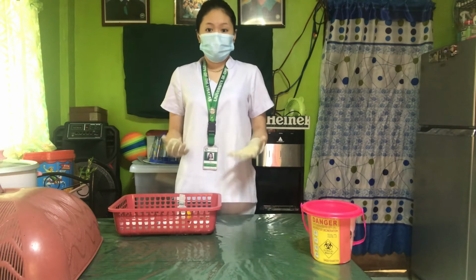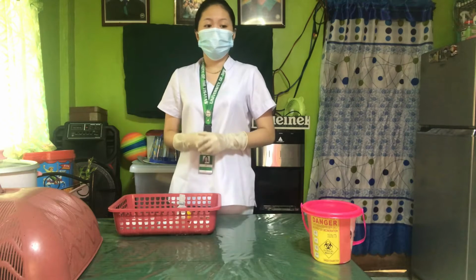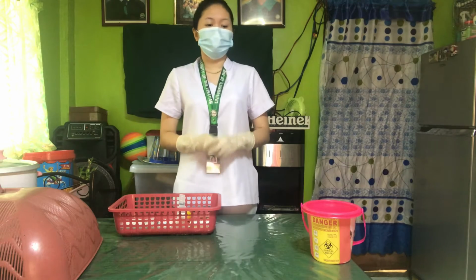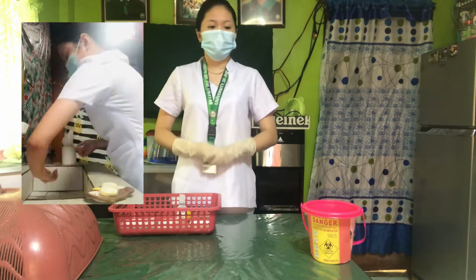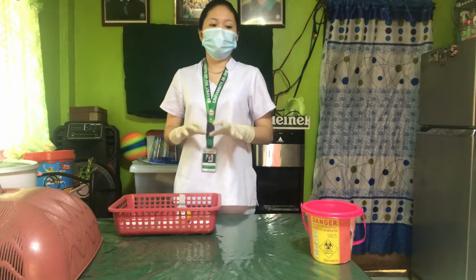So now, let's proceed to preparing medications from ampules. So the first step is perform hand hygiene and observe other appropriate infection control procedures. This is to prevent contamination and possible transmission of microorganisms. So I've already washed my hands and I've already done my gloves.